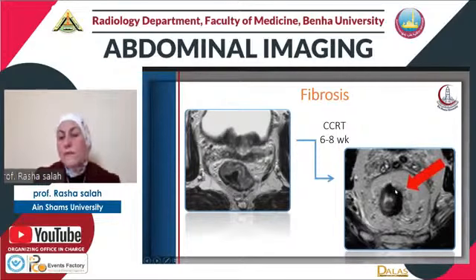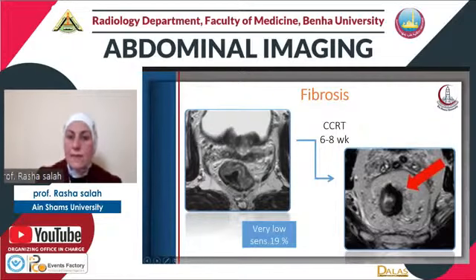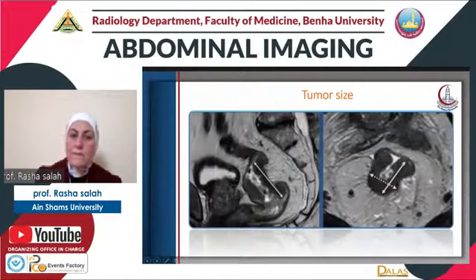No, because sometimes within these fibroses there are hidden small malignant cells, and they are masked by the fibrosis on the T2 weighted image. So how can we assess this residual tumor? We are going to tell it just in a few seconds.